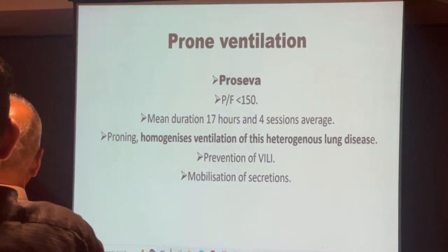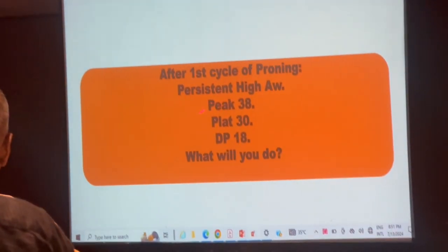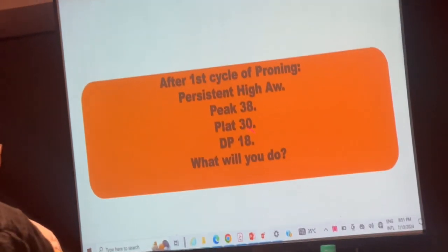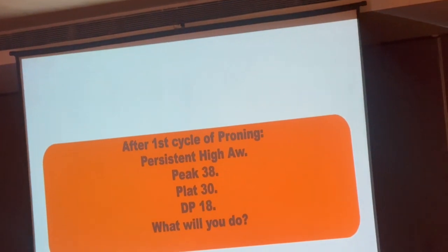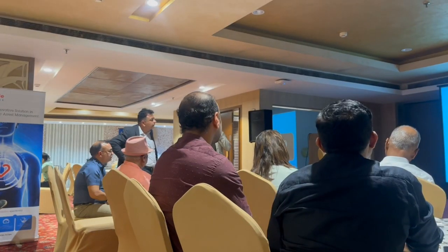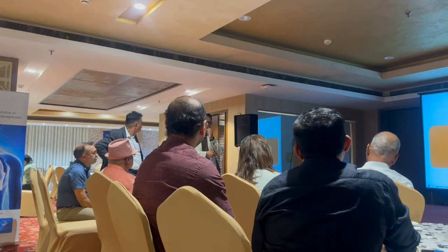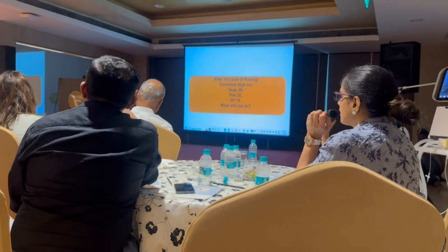We did, right, based on the PROSEVA trial. Still, after the proning, the patient's airway pressures were on the high side, but driving pressure was reduced from 22 to 18. What will you do in this situation? Ajul, or maybe Dr. Kapil. I would like to go for the second cycle of proning. Okay, so we will continue, but hypoxemia has got better, but what will you do, Ankita? The patient's airway pressures are high. It's not giving you the benefit in terms of what you want to obtain.